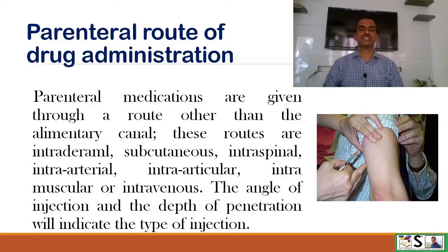Parenteral medications are given through a route other than the alimentary tract or GIT. These routes specially denote the injections: intradermal, subcutaneous, intraspinal, intraarterial, intraarticular, intramuscular, or intravenous. The angle of the injection and the depth of penetration will indicate the type of injection.